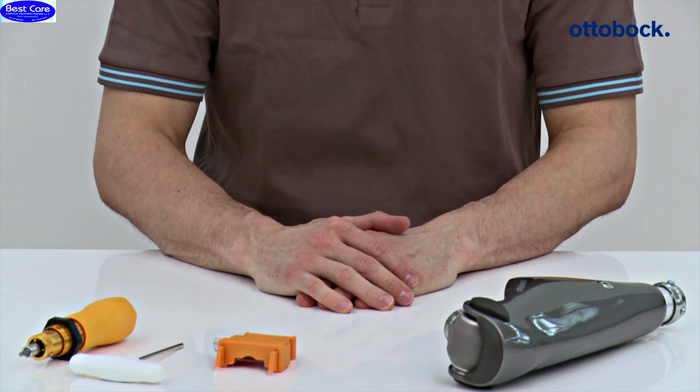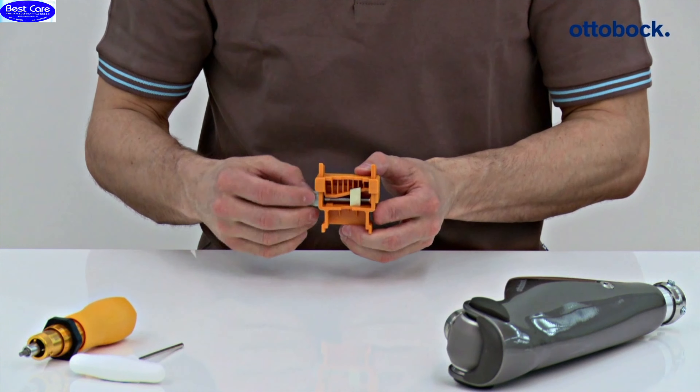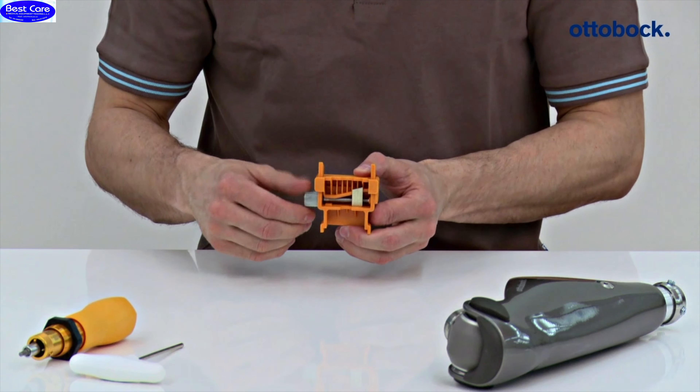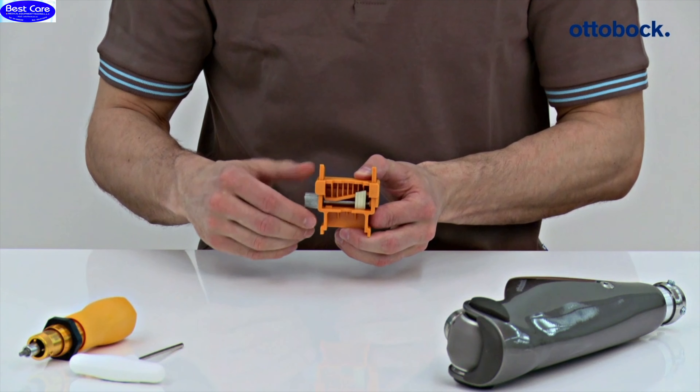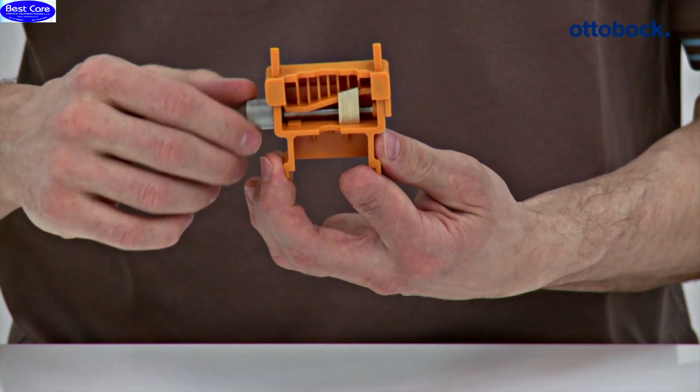The knee extender has to be used for bench alignment of the prosthesis. This ensures the recommended sagittal positioning of the prosthetic components — the foot, socket, and knee joint — relative to each other, and therefore offers the full functionality of the knee joint.